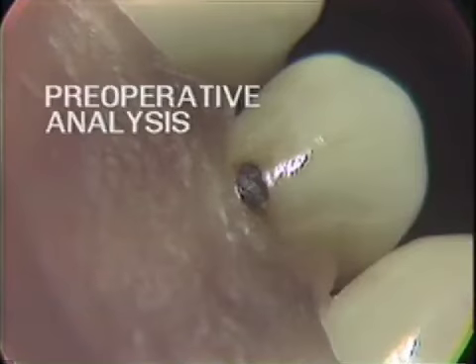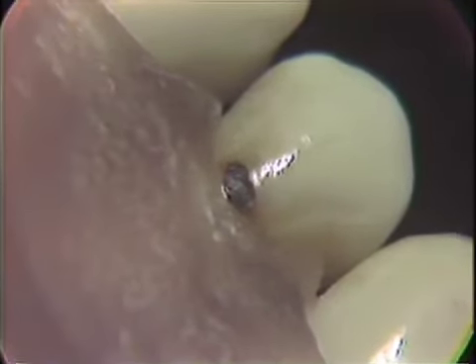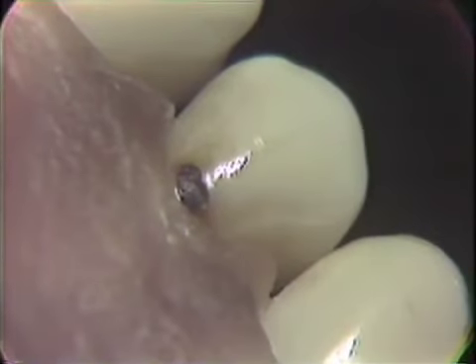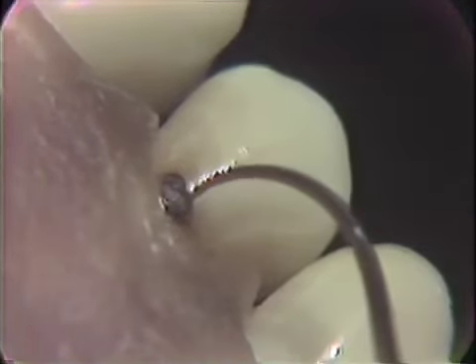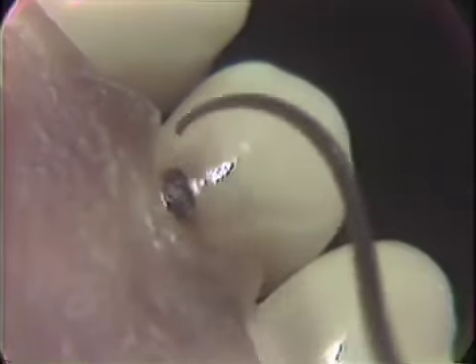As we consider the preoperative analysis for the Class 5 cavity, considering the restoration of this with cohesive gold, we want to consider a number of factors. One being the position of the carious lesion in relationship to the gingival tissue.